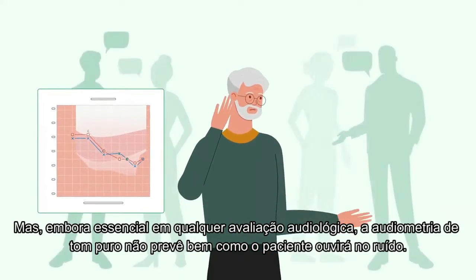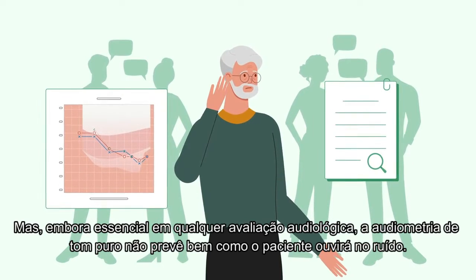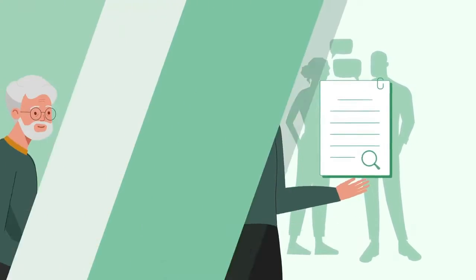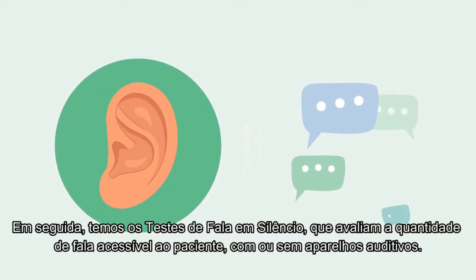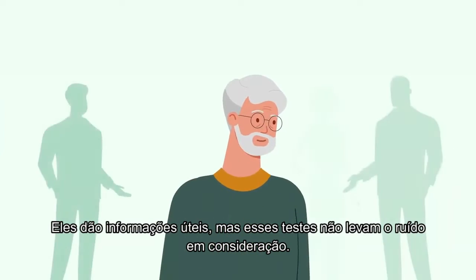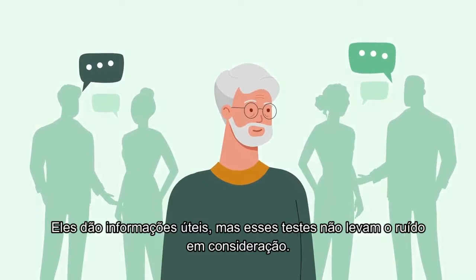Although it is an essential part of any audiological assessment, it has been shown time and time again that the Pure Tone Audiogram is a poor predictor of how well a patient will hear in noise. We then have speech testing in quiet. These tests define the quantity of speech the patient has access to, with or without their hearing aids. They give useful information, but only tell one half of the story, as noise is not considered during these tests.